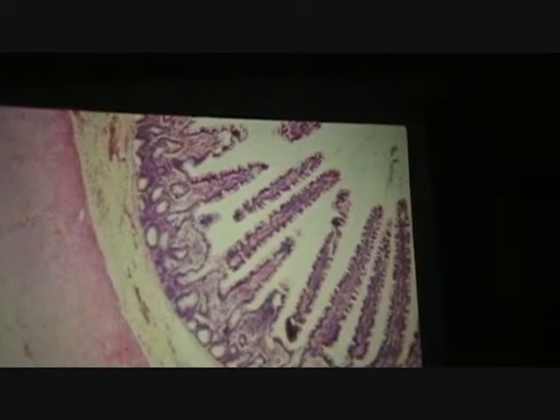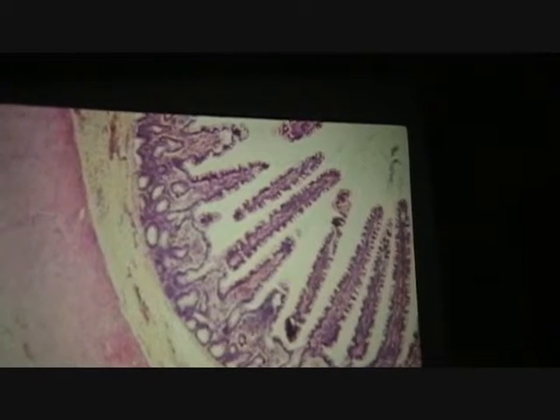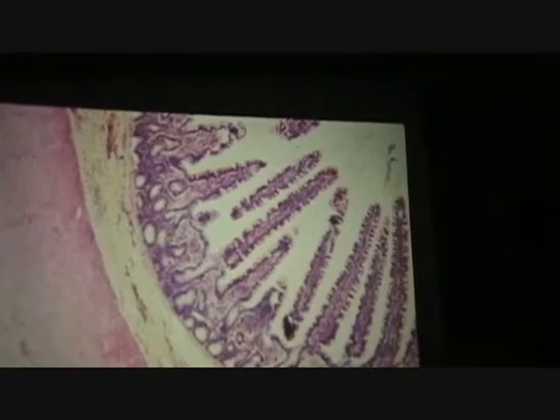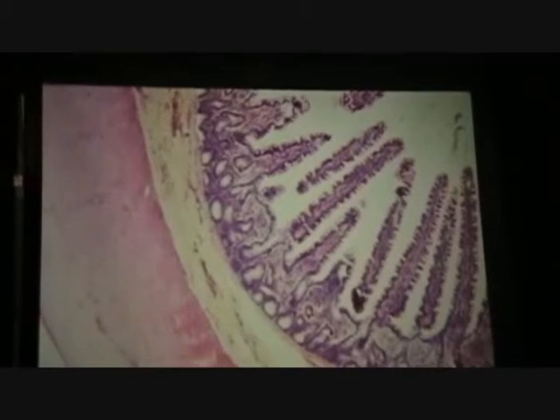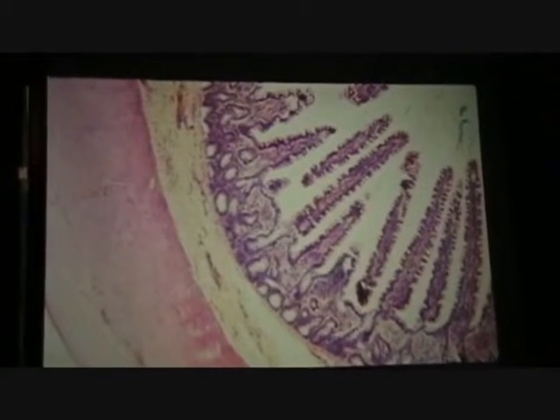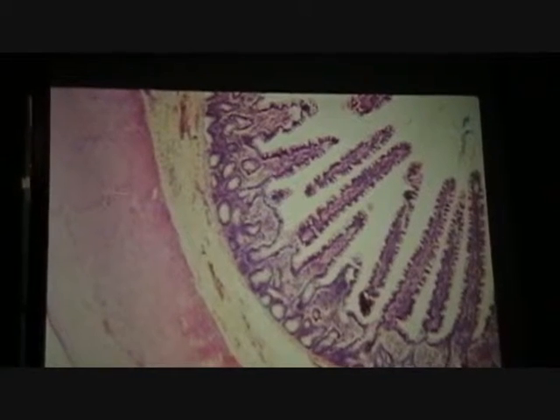There's one structure I would want you to see to tell me what compartment this is from. GI. Do you see villi? What are these?